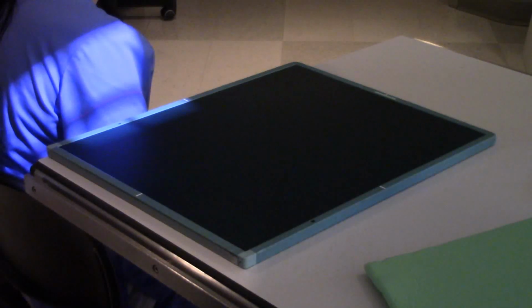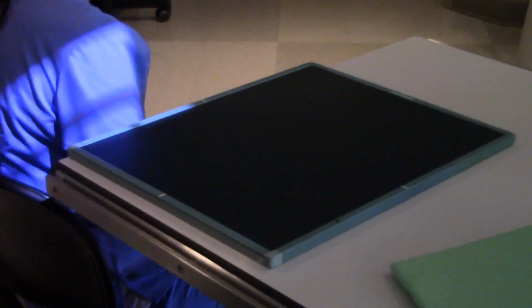We eschew the idea of a correct image receptor size. We're just going to use the big plate for everything.